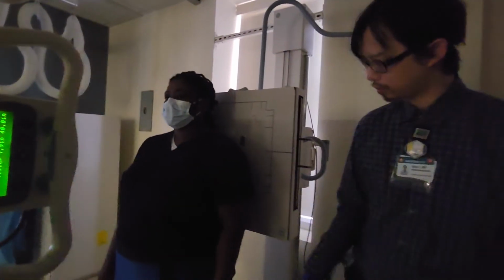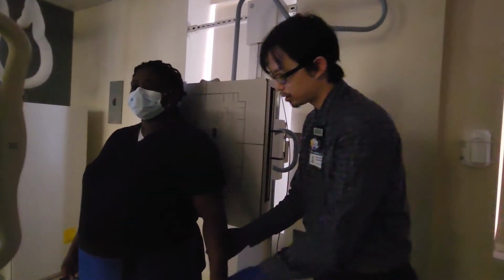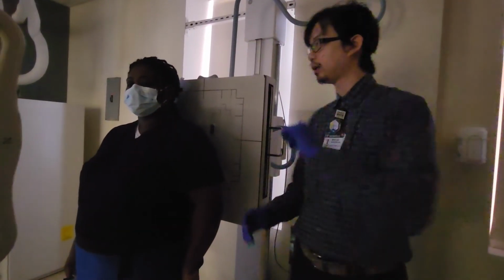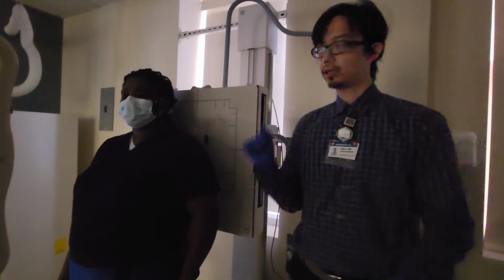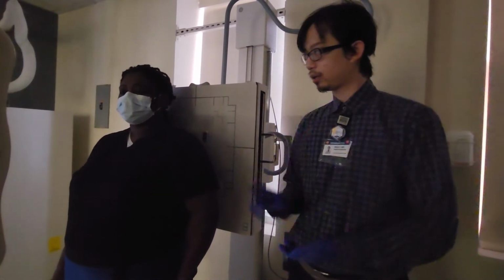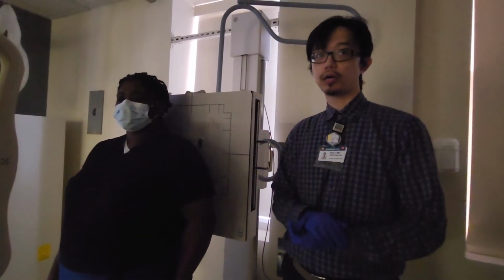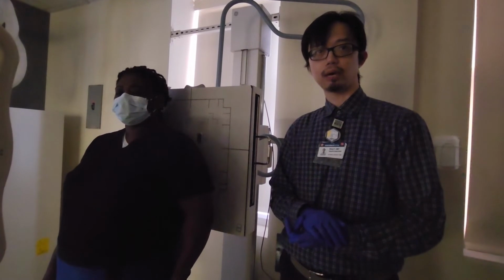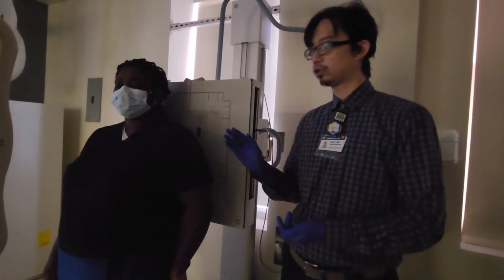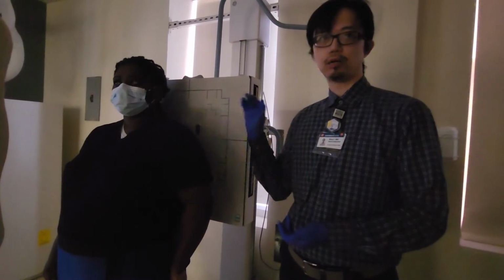All right, so here's our external X-ray, boom. Here's our internal X-ray, boom. And now we need to do the Y view. I need to oblique my patient. If you are a tech and you want to oblique your patient right now, do you think you would prefer an AP oblique or a PA oblique? Do you think you would want to do something that's LPO, RPO, or something that's LAO, RAO?